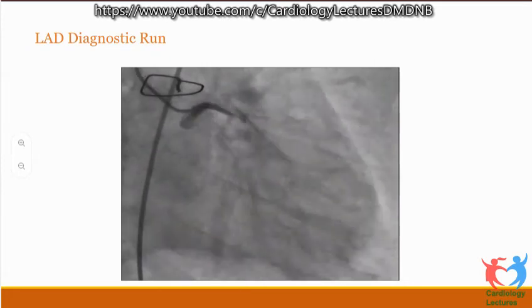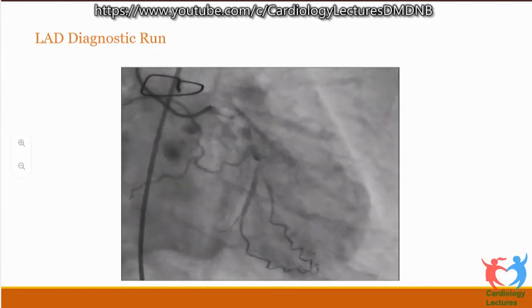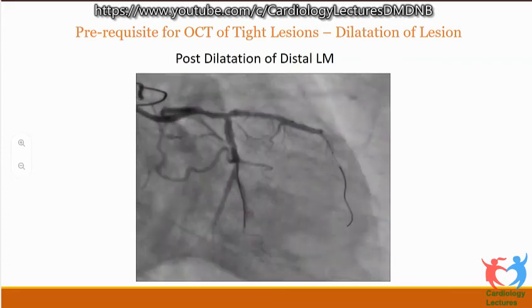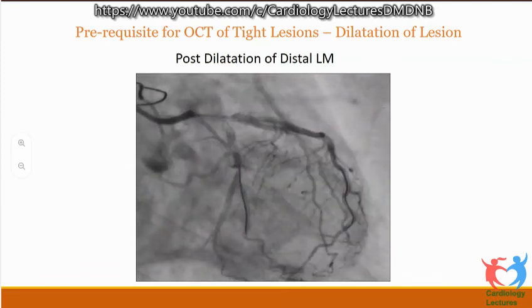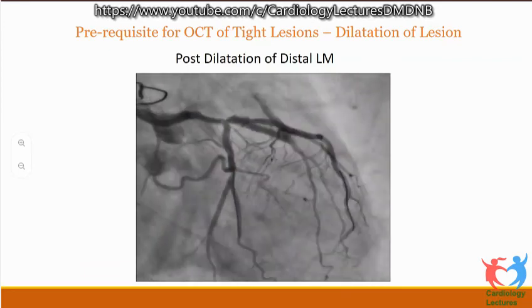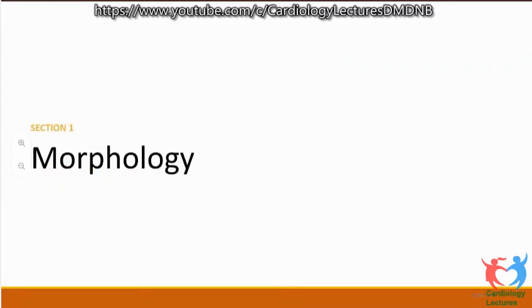This was a post-op CABG case, which had very tight distal left main disease. So we dilated, which becomes mandatory because your OCT catheter will not go in otherwise. In these situations, you use a 2 millimeter balloon and dilate with it. This allows the OCT catheter to get in. And now you can see the venous graft is flowing well because you've dilated and contrast is going through this. So what we've done, we've applied the MLD here.